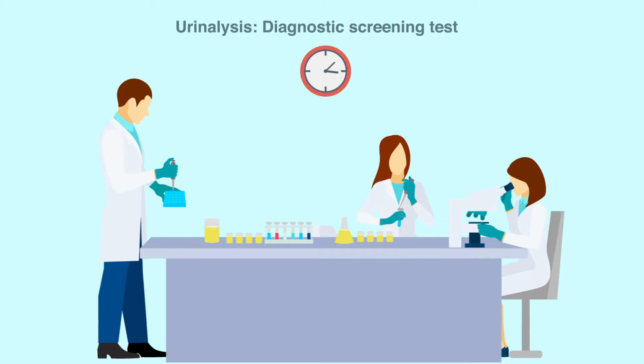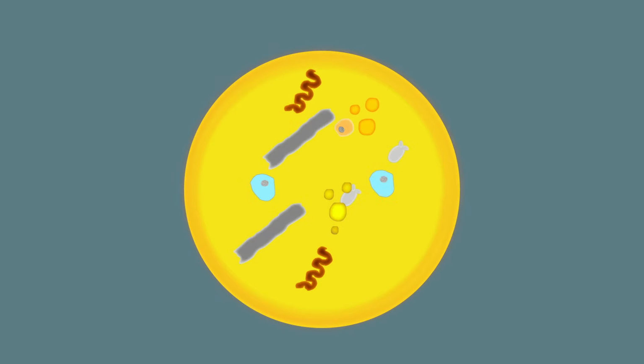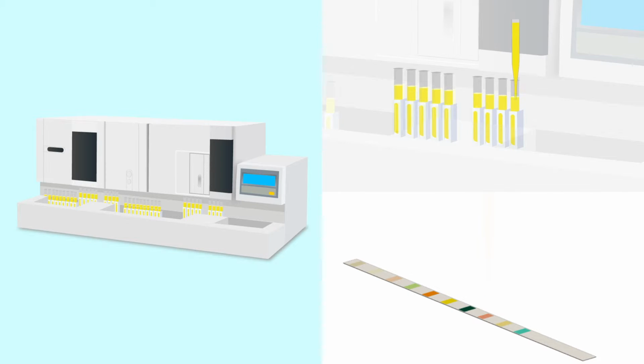Urinalysis is a diagnostic screening test for individuals with various suspected illnesses. Until recently, microscopic urine sediment analysis was the most widely accepted method, but this is time-consuming and unreliable. Currently, new technological advances have paved the way for significant progress in automated technologies.